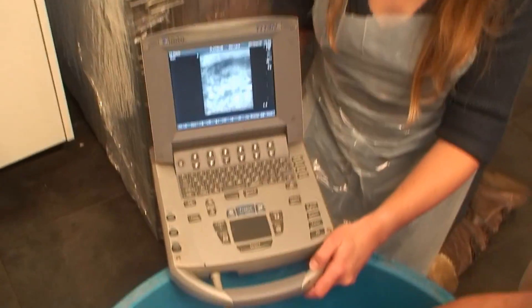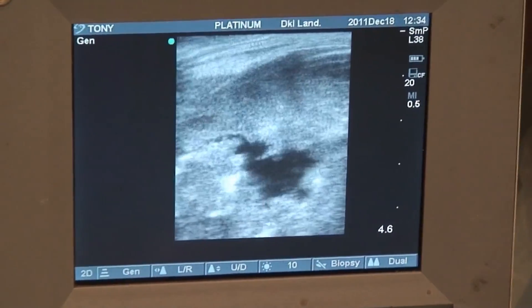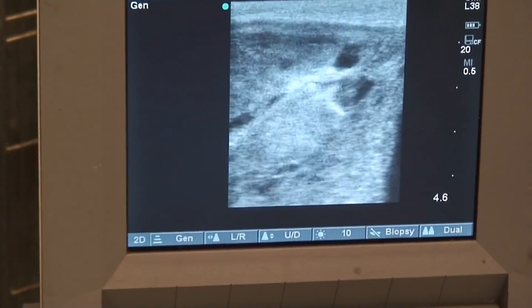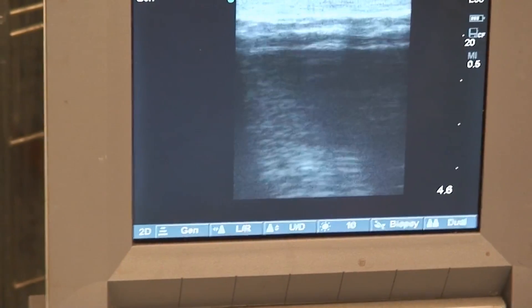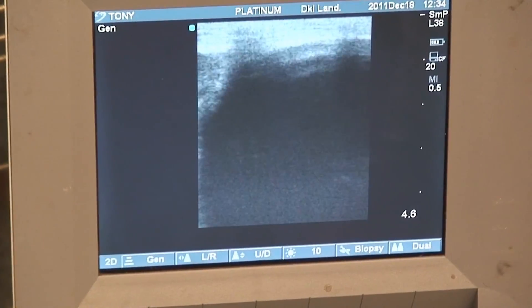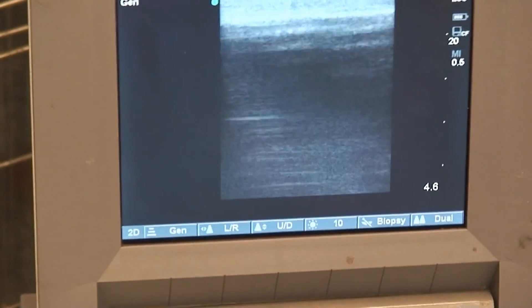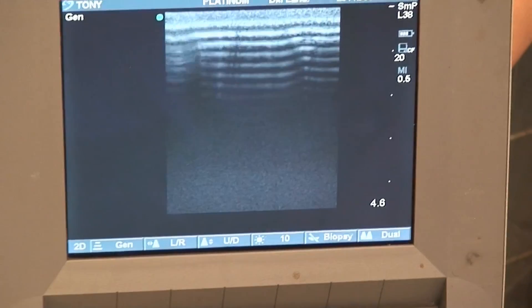Here you see the different grey areas with another black area which is fluid. This is typical — the view for a tumor in the ovaria. Here we've seen different grey areas, and the black, as you can see, is in fact the liquid, which is typical for a tumor. So we've changed to the right side.